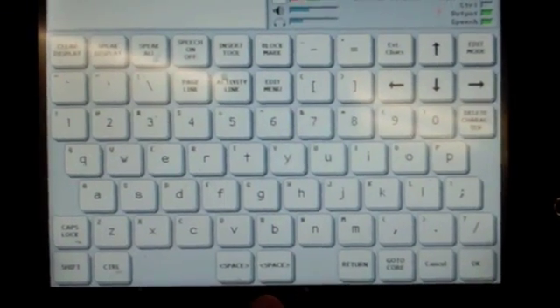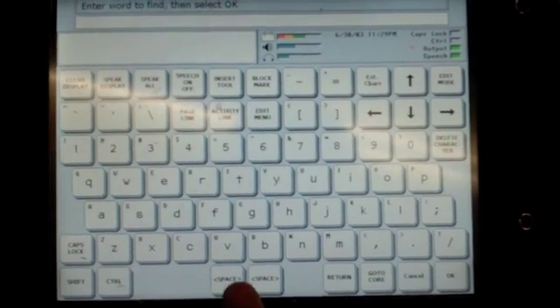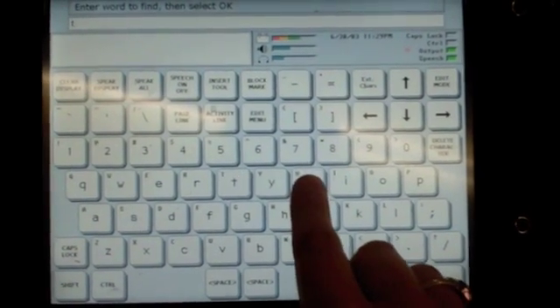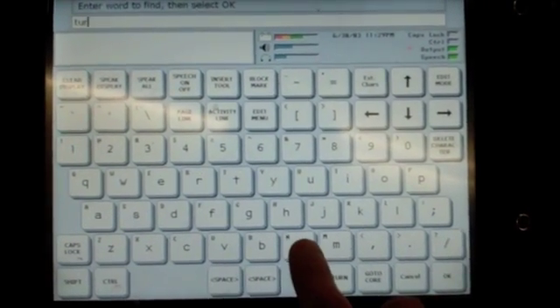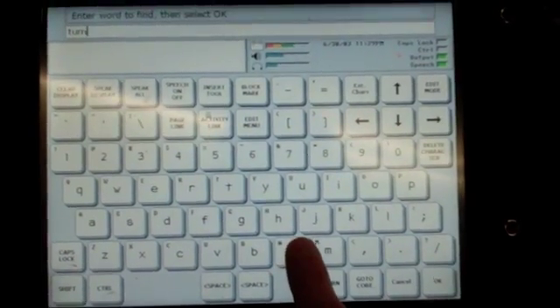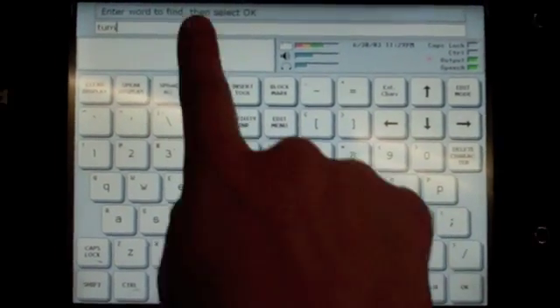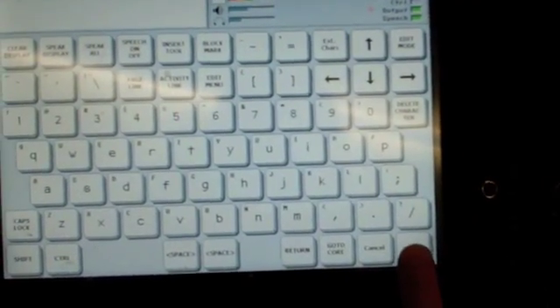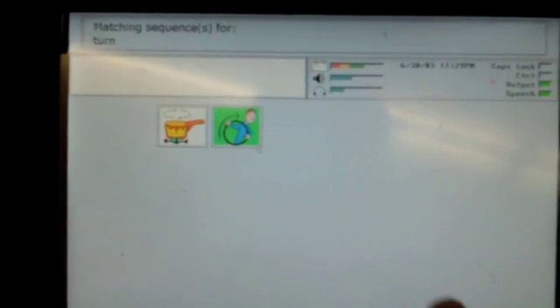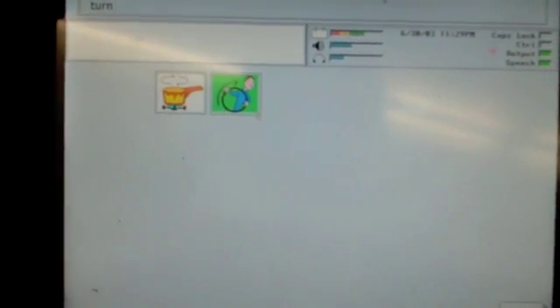And then from there I get a keyboard in which I can also find. So again, I'm going to try to find the word turn. It has a regular QWERTY keyboard. I've typed it in. It says select okay. So I go to the bottom and press okay. And then it gives me the same sequence that I can find for.